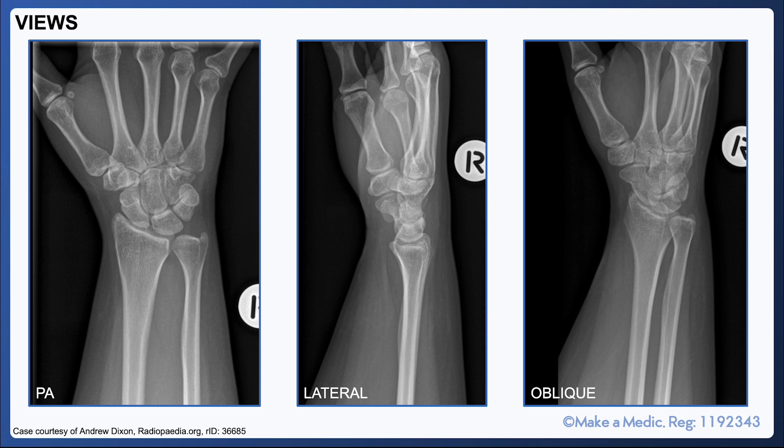When an x-ray is performed of the wrist, you will likely see two views: the PA and the lateral, and perhaps an oblique view as well. So this is what a normal wrist should look like.